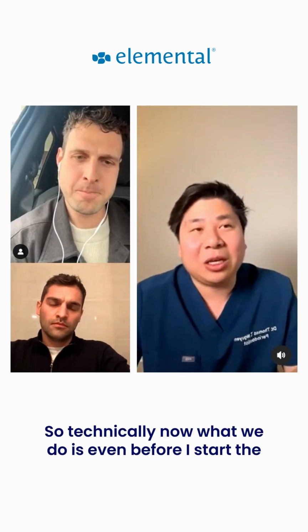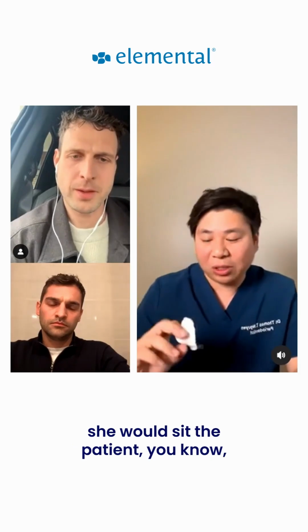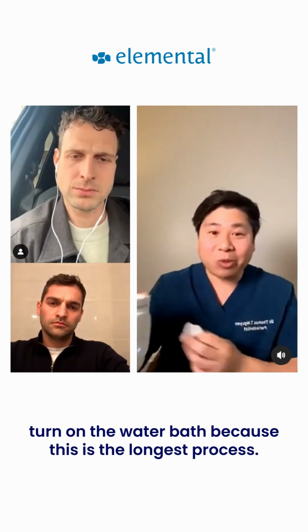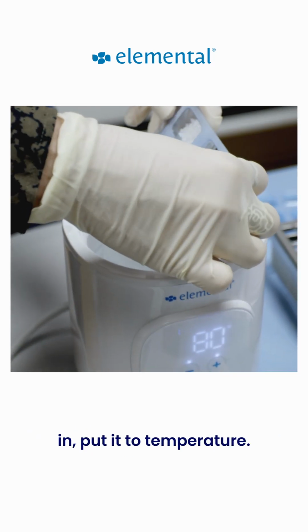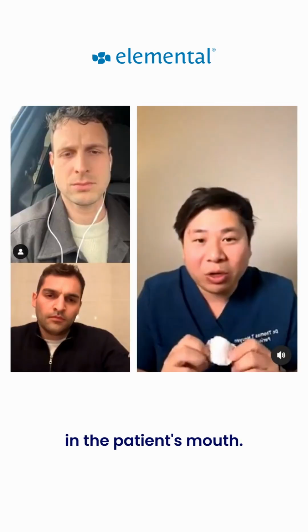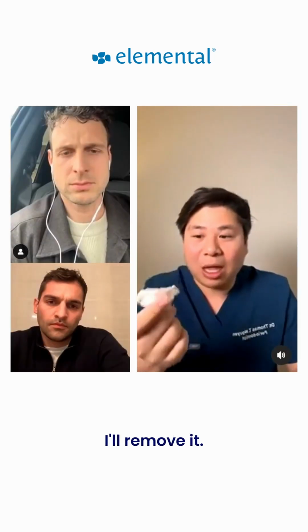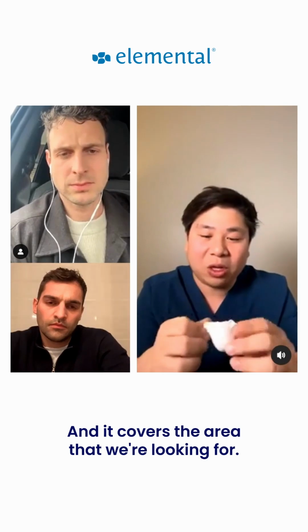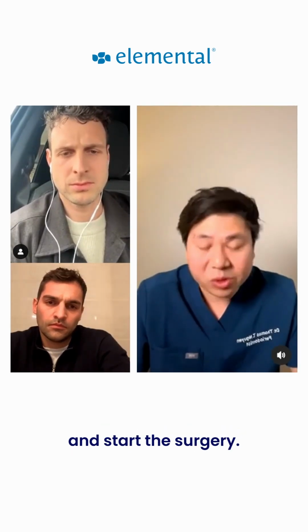So technically now what we do is even before I start the surgery or any numbing process, she would sit the patient, turn on the water bath because this is the longest process, maybe 5 minutes before the patient gets in, put it to temperature, and then she's going to do that whole process to put it in the patient's mouth, let it set. I'll remove it, I'll trim it and make sure that it fits and it covers the area that we're looking for. And then after that, we can numb the patient and start the surgery.